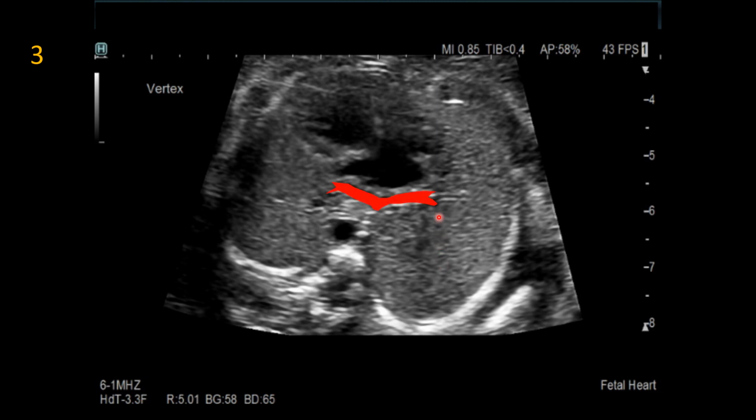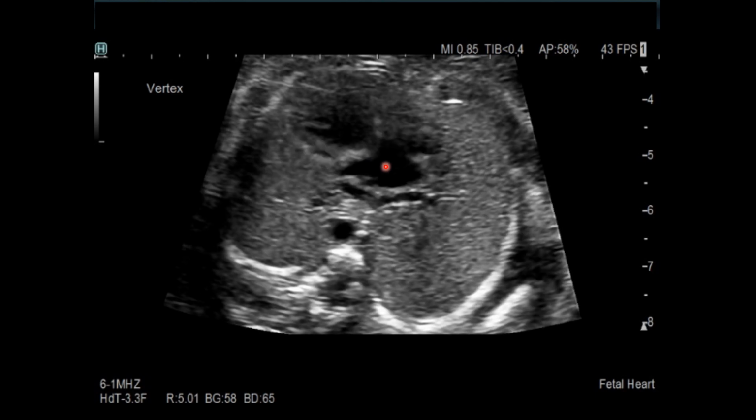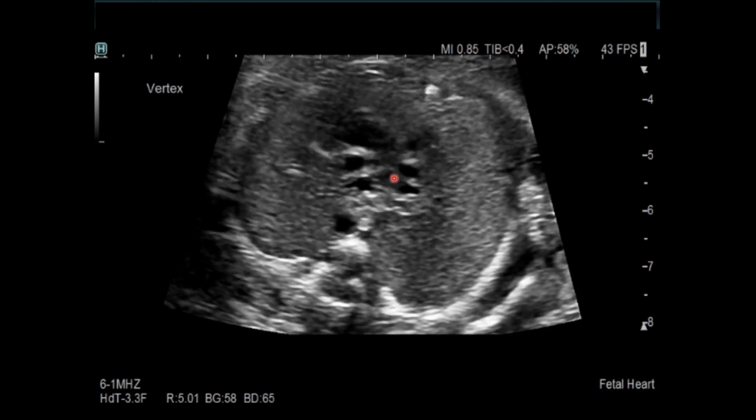And here, at the end of that sweep, behind that common atrium, is a pulmonary venous confluence that connects in the center and drains to this venous structure that we showed previously in the previous slide. Put that all in motion from that superior cephalad region of the chest all the way sweeping down.